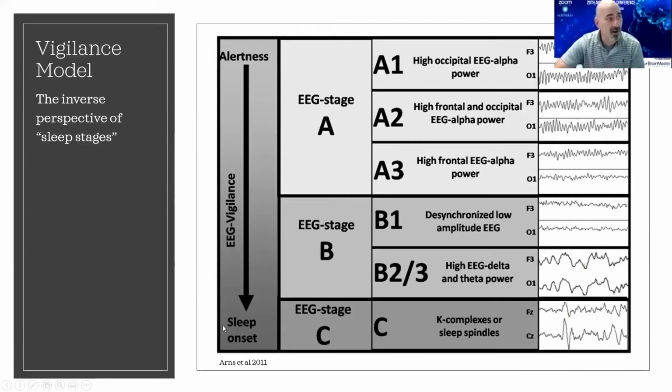And when we talk about alertness and sleep onset in stage A1, high occipital EEG power, dominant in the back of the head. Here we're looking at F3, this is frontal left, O1, posterior left, and we're talking about alpha being dominant in the back of the head. A2, alpha is seen both up front and in the back of the head, quite common. We also see this commonly with OCD and ODD in an eyes open condition. A3, some people don't really spend a lot of time in this state, but some do. And here the alpha is dominant up front, but we see it drop out in the back of the head.